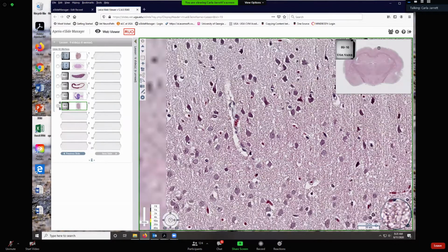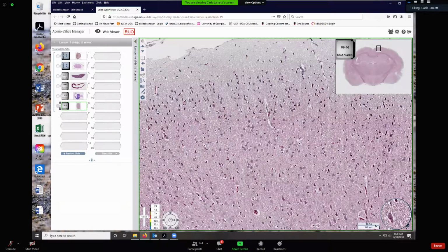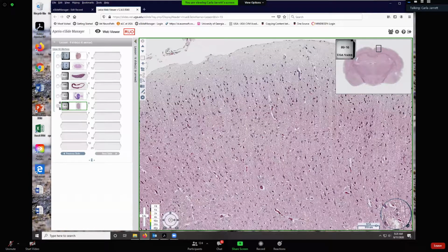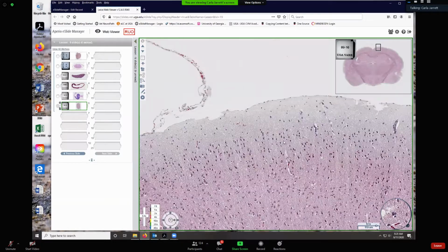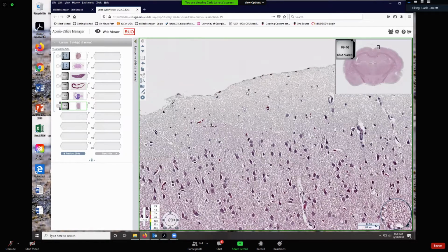Now we aren't going to learn all of the layers, there are different names for all these different layer organizations of neurons. There can be multiple layers, 6, 9 different layers, depending on the species and the region of the cerebral cortex. So we want you to just know that this is all gray matter. And look how right here, this outer inch or two, we don't really have neurons here. We just have the cytoplasmic processes, and some support cells.